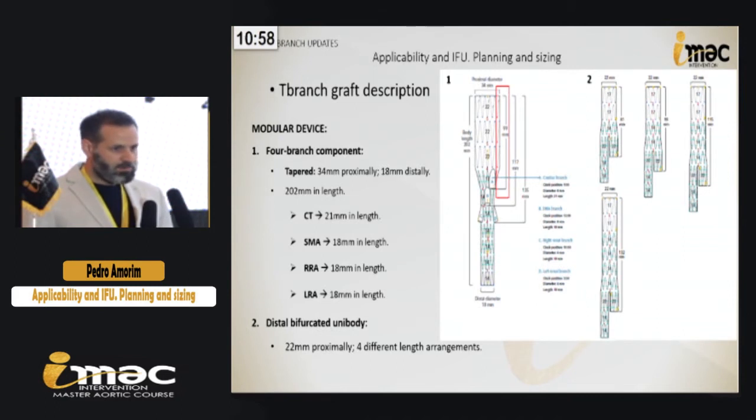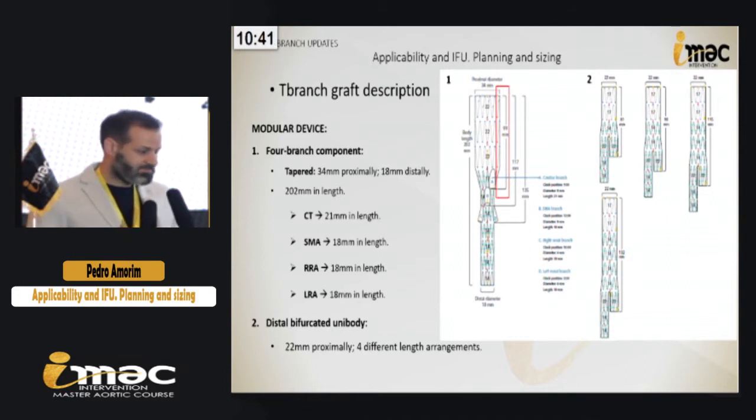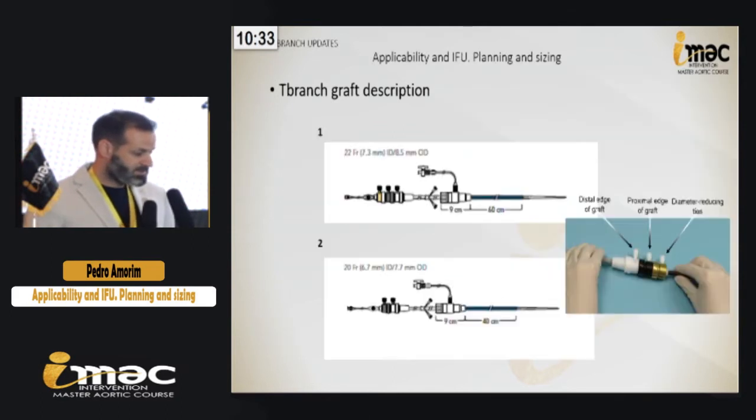We must be very aware of the dimensions of the graft, the takeoff of the branches, the size of every branch, the diameters. This is one of the most important messages that I have. Keep in mind that we must know the graft very well, all its features. And the distal component is like a regular EVAR to fit in the first component. This is an overview of the delivery system, very friendly.